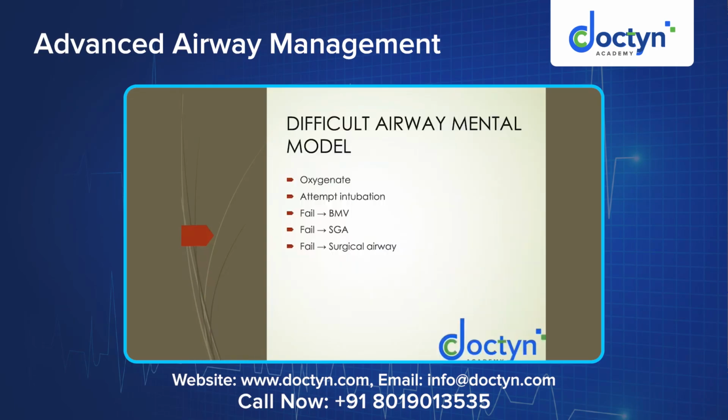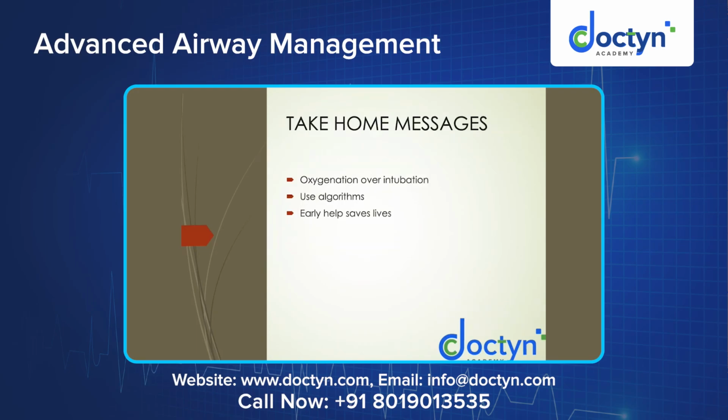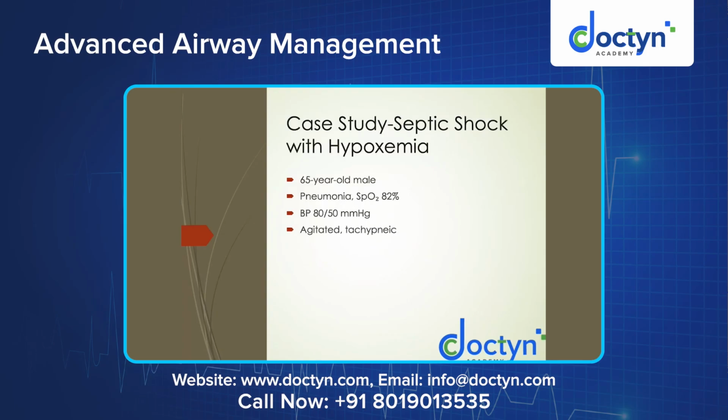So that's why for the difficult airway, the mental model has to be established well. This is the main purpose of this class. Oxygenate, oxygenate, oxygenate. Oxygenation is paramount. Attempt intubation. If it is failed, restart bag mask ventilation. If that fails, use a supraglottic airway device. If that is also failed, try to establish cricothyrotomy, a surgical airway. So the take home message is oxygenation over intubation always. Use the clear algorithms, and understand why they have been established. Early help always saves life.